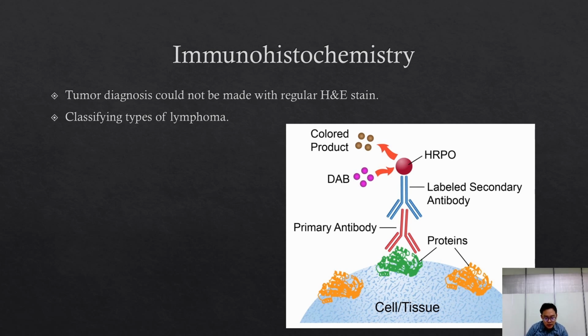If we are not sure what type of tumor it is, or if we need to subtype the tumor, we can use those cell markers to determine more definitively what type of cells they are, and get a more confident diagnosis or get to a more derived diagnosis than we could get with just a regular HE stain. In addition to detection of tumor cells, IHC has been used to detect pathogens like feline infectious peritonitis or leptospirosis.